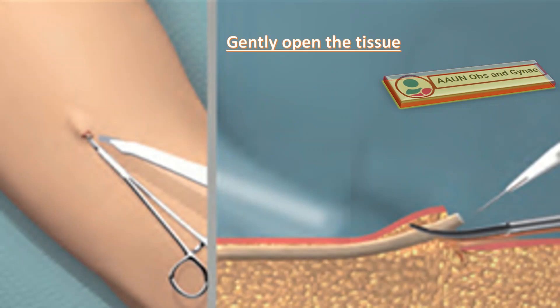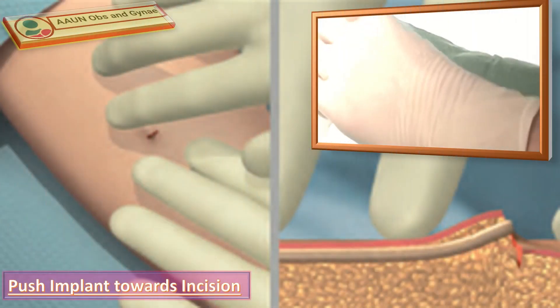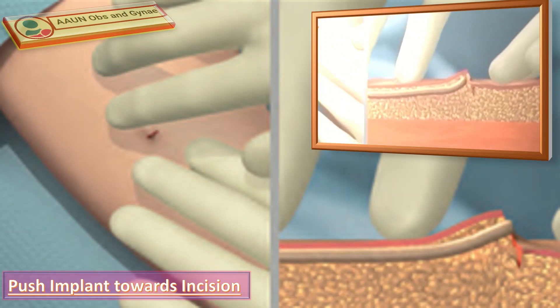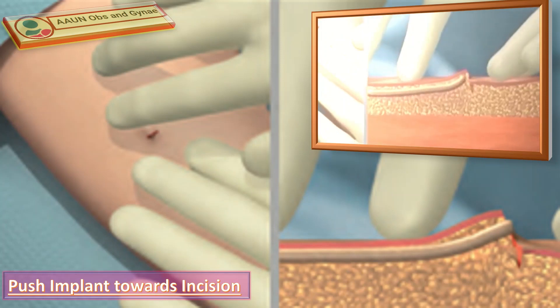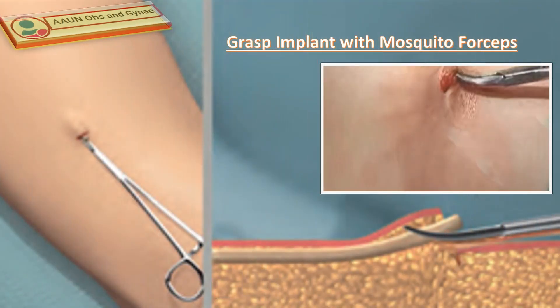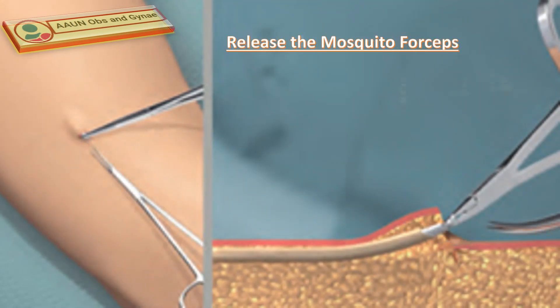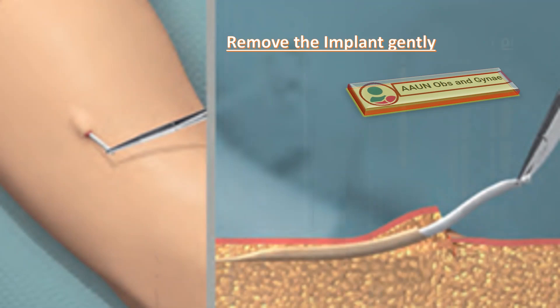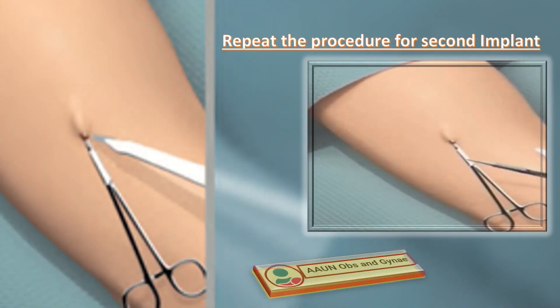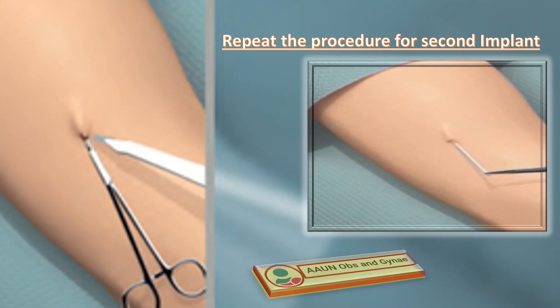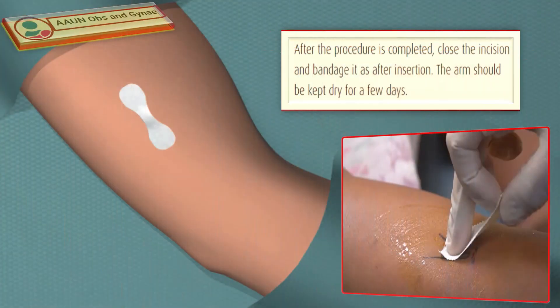Use a scalpel to very gently open the tissue and capsule around the implant. Push each implant gently with your fingers toward the incision. When the tip of the implant is visible in the incision, grasp it with the mosquito forceps. Then grasp the end of the implant with a second forceps called the crile forceps, release the mosquito forceps, and remove the implant gently. Repeat this procedure for the second implant and measure the length of the removed implant — it should be 43 mm — to confirm both Jadelle implants have been removed.